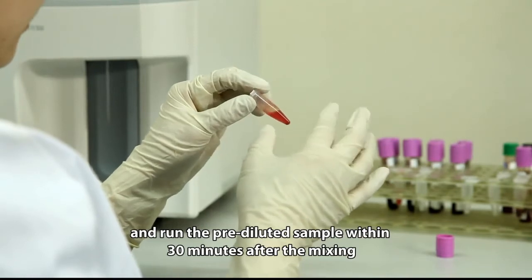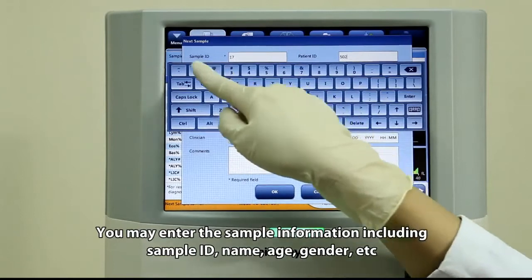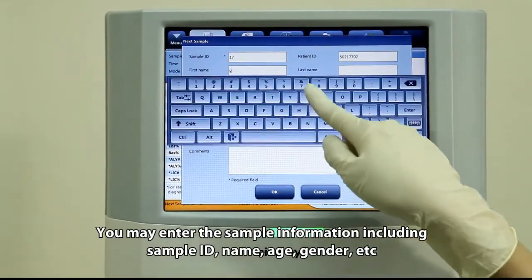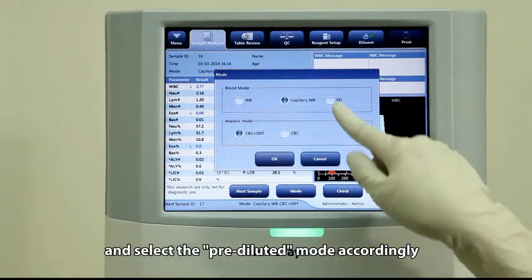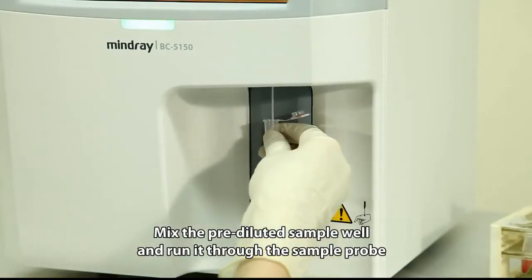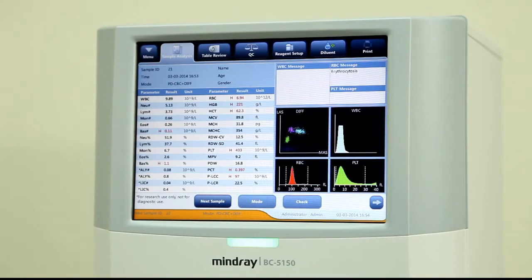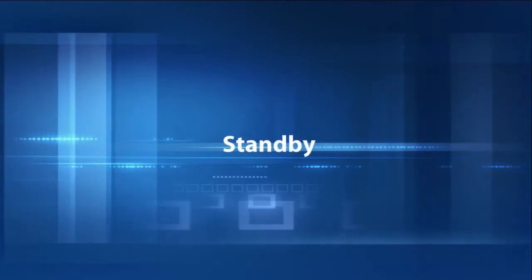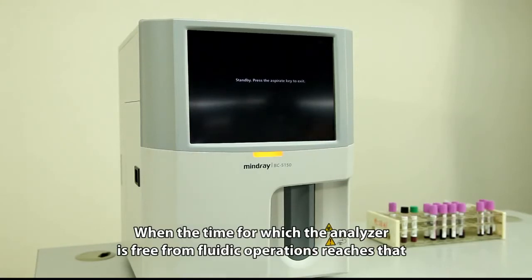After mixing the capillary sample with the diluent, wait five minutes and then remix before running the sample. Run the pre-diluted sample within 30 minutes after mixing. Enter the sample information including sample ID, name, age, gender, etc., and select the pre-dilute mode accordingly. Mix the pre-diluted sample well and run it through the sample probe.